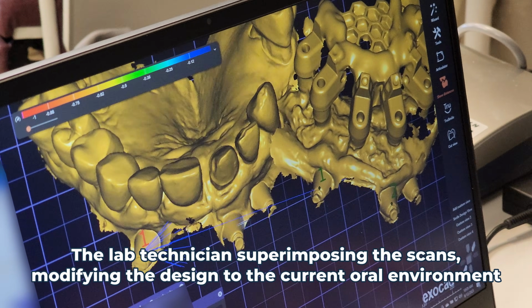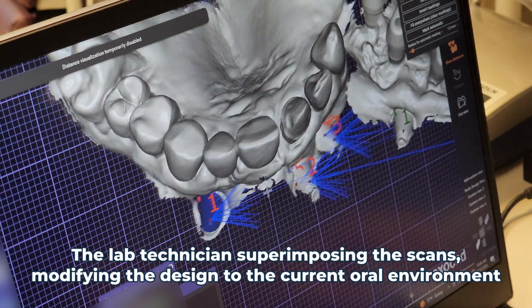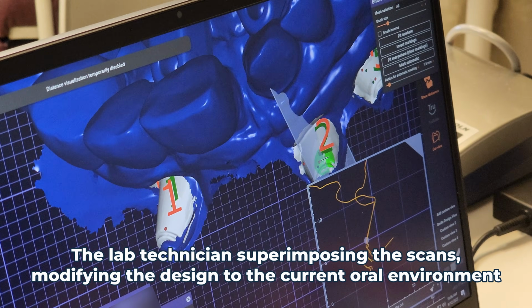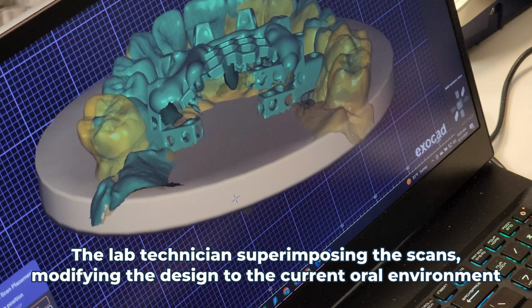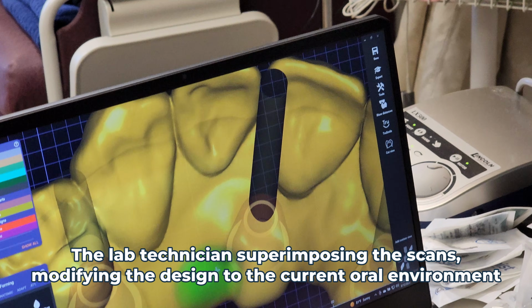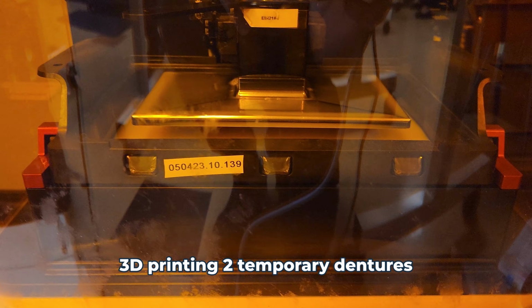Now, while all that is setting in the stone, the lab technician is superimposing all of the scans, modifying the design to the current oral environment, and adding digital analog implants into the 3D scans. Since the prosthesis has already been designed before the appointment, we just need to add the MU abutment attachment housing sockets and also the screw channels into the 3D denture design. And we build up any weak spots we've made while creating these features. Also at this time, we add bars into the design of the provisional to minimize distortion and add strength in the fabrication process. Now we just 3D print the provisional with a very strong medical grade resin.